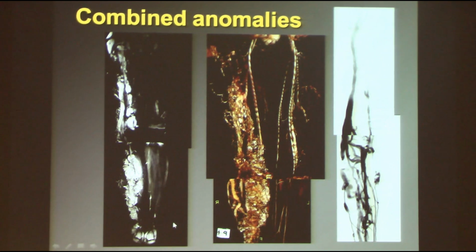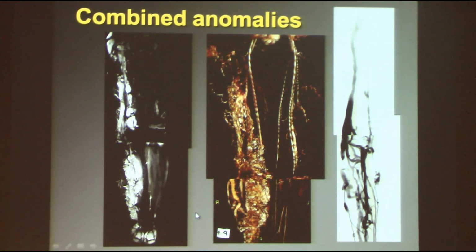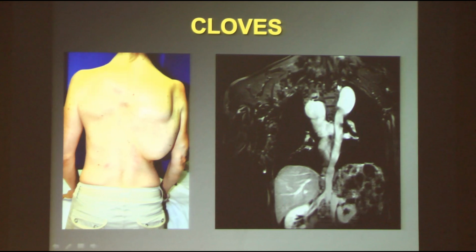More and more bizarre things can be seen. This patient has similar veins to the other KTS patients, has relatively small femoral vein, but also has these really strange low flow malformations. You might even think it's like FAVA, fibroadipose vascular anomaly, very large and abnormal looking veins in the chest.